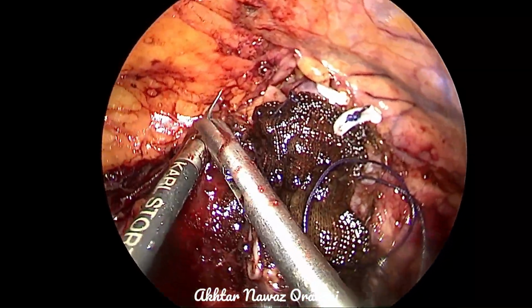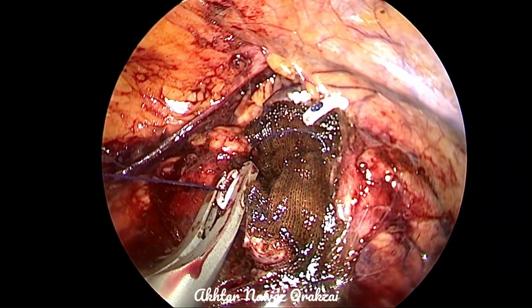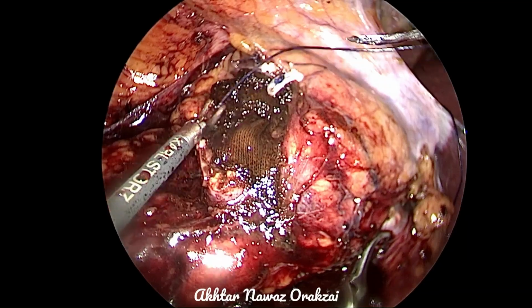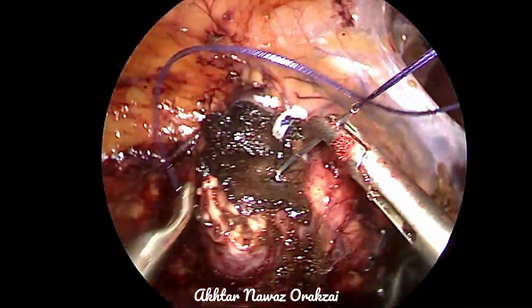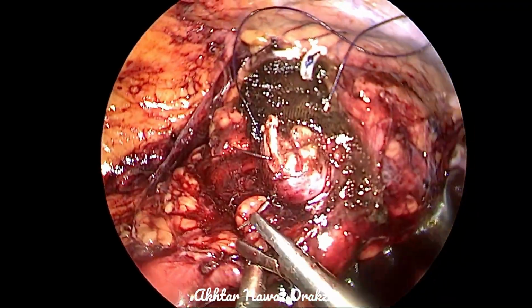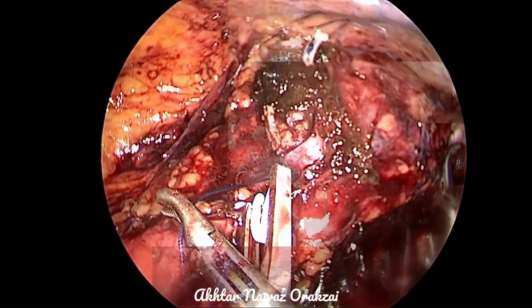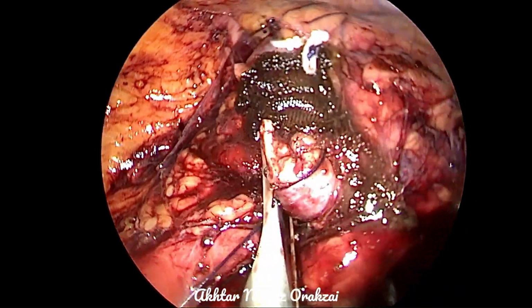Another important thing is that it is also securing this Surgicel very tightly over this rent, so it will play the role of a hemostatic suture as well. So these two layers are about to get completed. Hem-o-lok clips are used to tighten the suture and keep them in place so that they do not get loose and lose all the purpose.